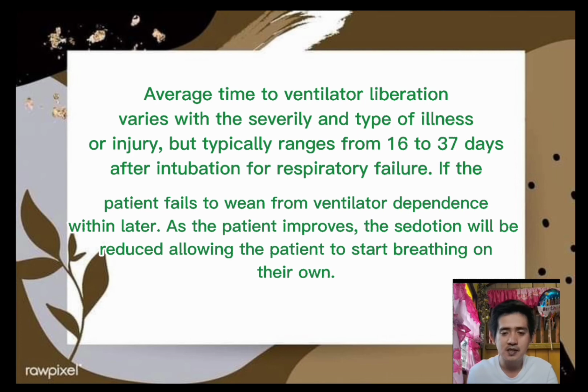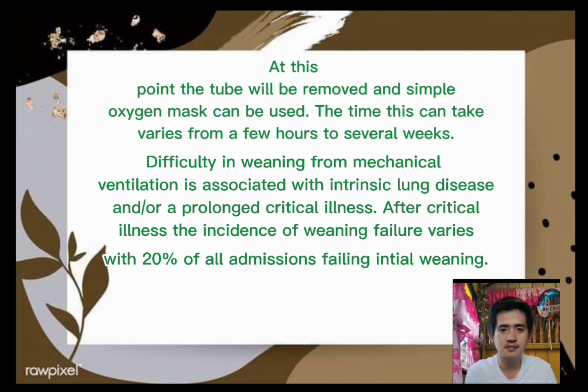As the patient improves, the sedation will be reduced, allowing the patient to start breathing on their own. At this time, the tube will be removed and a simple oxygen mask can be used. The time this can take varies from a few hours to several weeks.